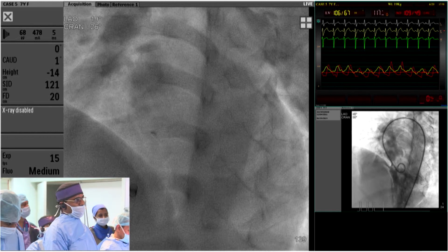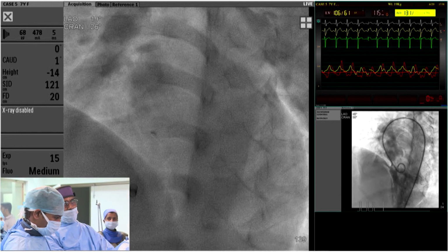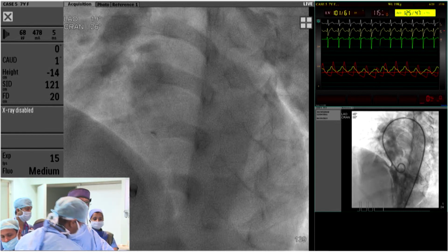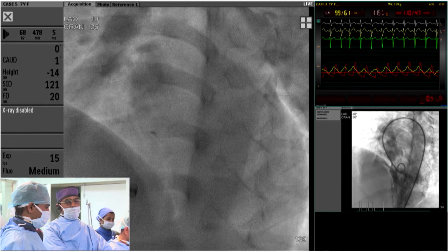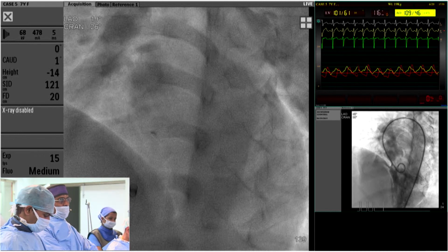We discharge at the end of 48 hours. We don't give any aspirin. We give periprocedural heparin, 100 units per kilogram, and one dose of cefuroxime, an antibiotic, and no further antibiotics, no further heparin. It's coming out. The sheaths will be removed immediately in another few minutes. Yeah. Okay. We have taken a 6 French venous sheath and a 5-French arterial sheath, both will come out shortly.